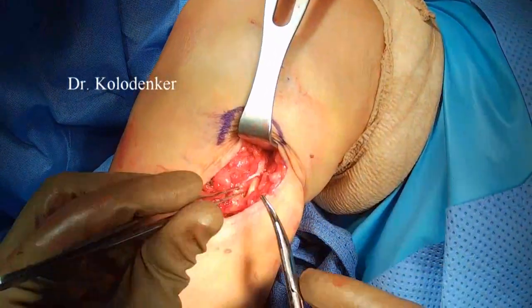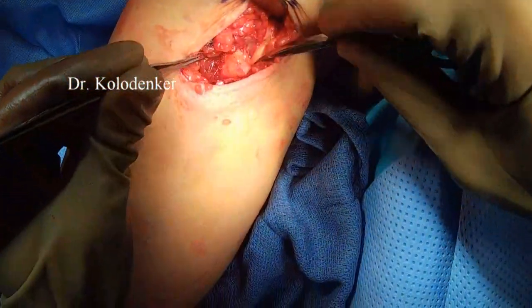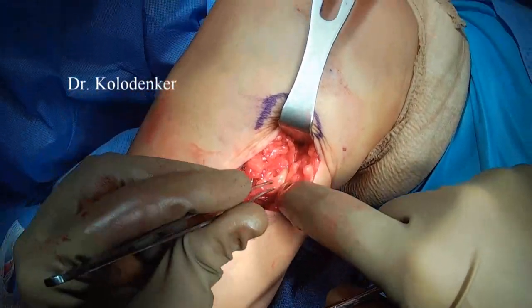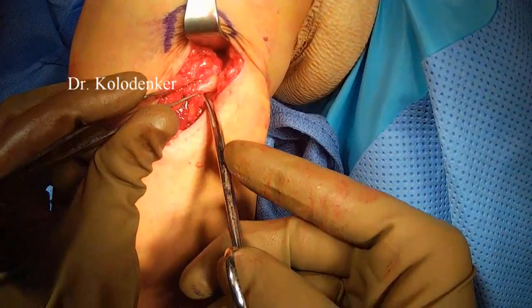Get behind it and don't be too scared of it here. You can see how thick that nerve is in that region. Approximately around the army navy retractor, it's more of a normal structure. But as you go distal, kind of where I'm touching around there, a little bit more distal to it, it looks a little bit more fatty than it should be.